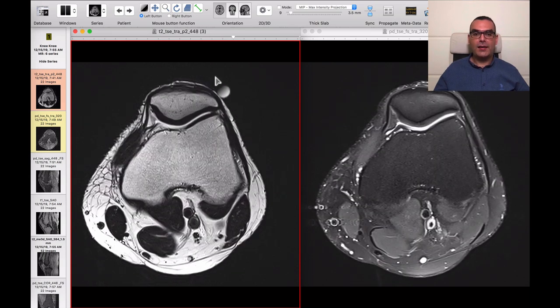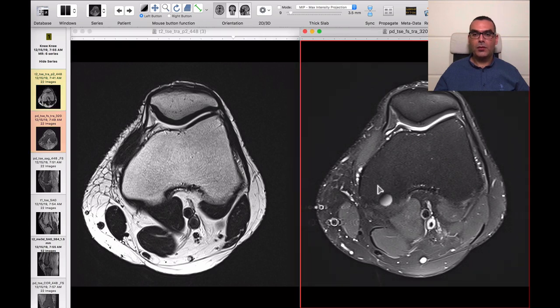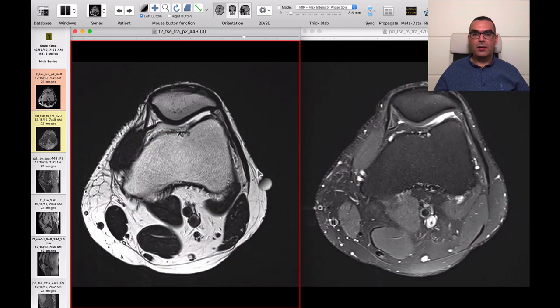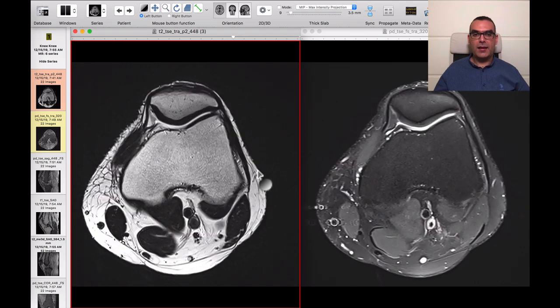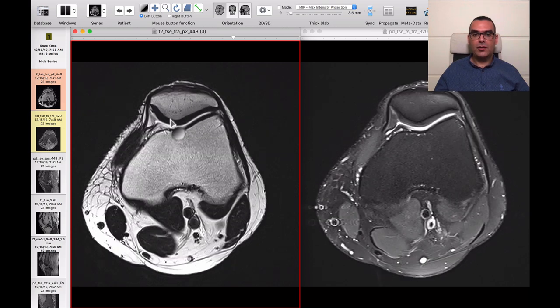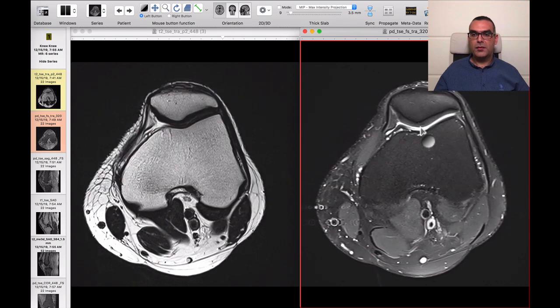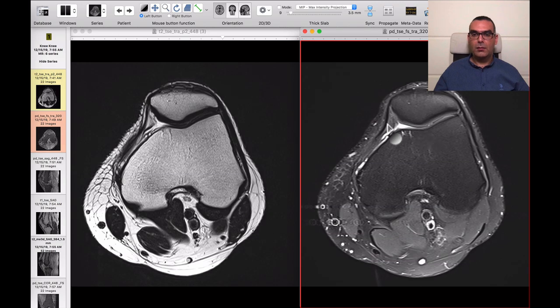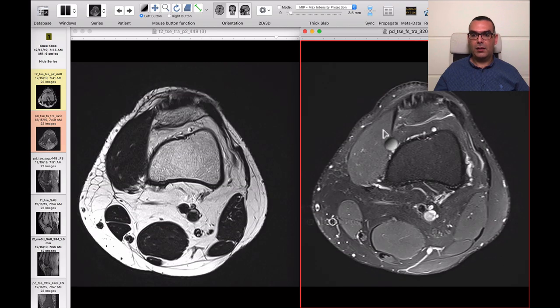For Case 1 we have the axial T2 and axial PD with fat suppression. We start by examining all structures in the axial. First, let's take a look at the patella and the retropatellar cartilage, examining this on the T2 and PD fat sequences. We don't see any particular pathology — the retropatellar cartilage and both retinacula, medial and lateral, are apparently intact.